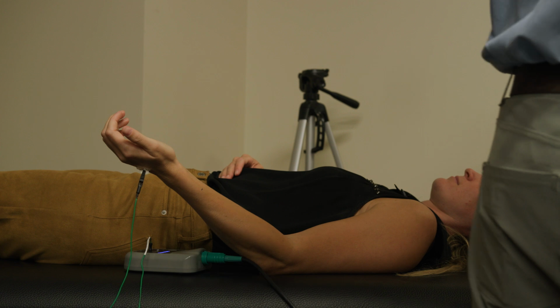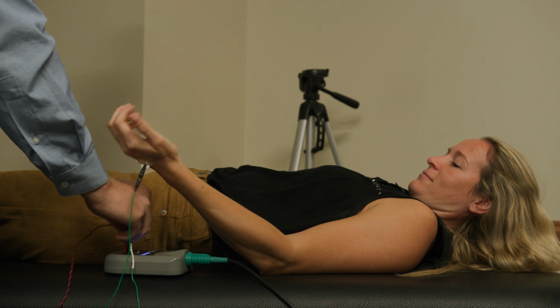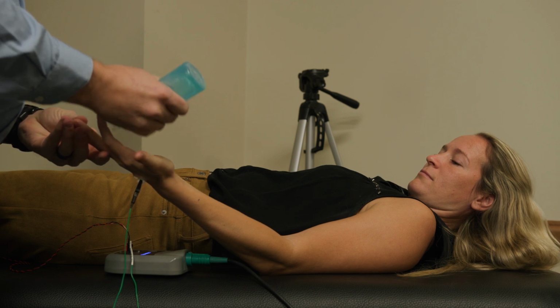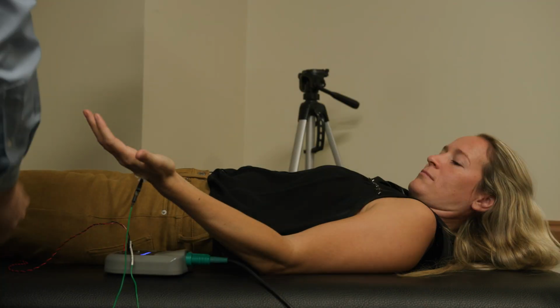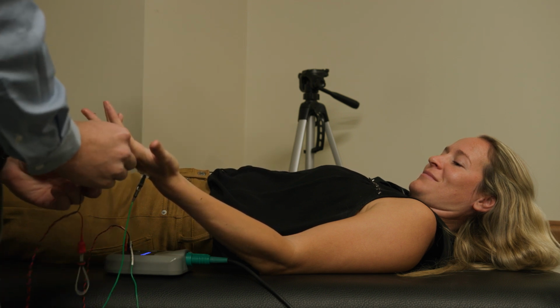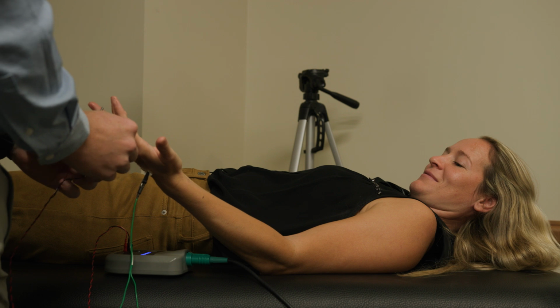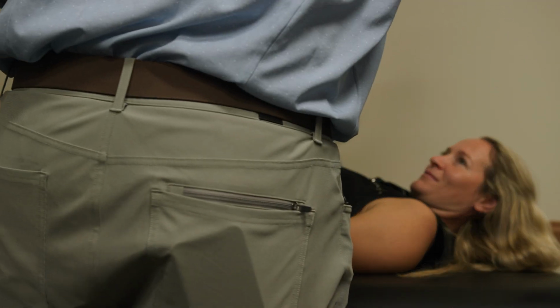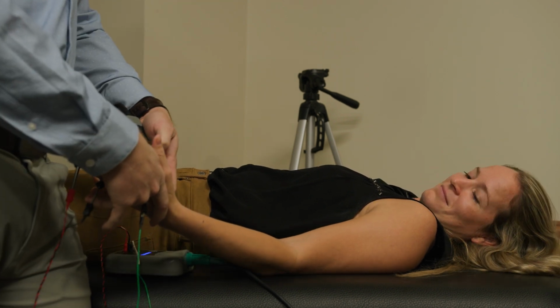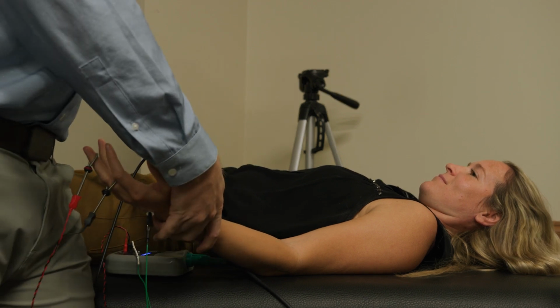All right, so we're going to use the third digit for testing sensory fibers of the median nerve. This is just a little ultrasound gel. And then these are just like the stickers, they just work better on your fingers. And then this feels pretty much the exact same as what we did before. A little snappier here.